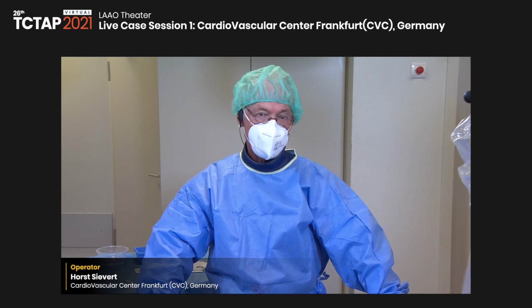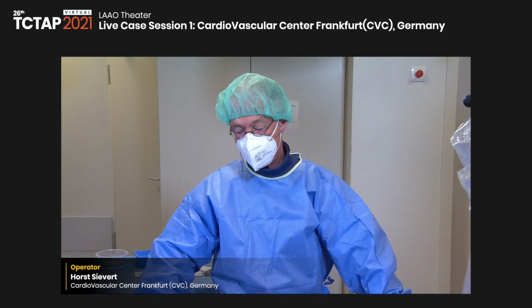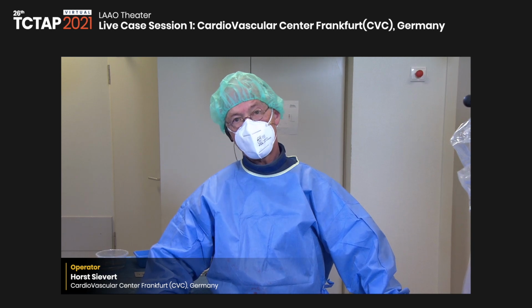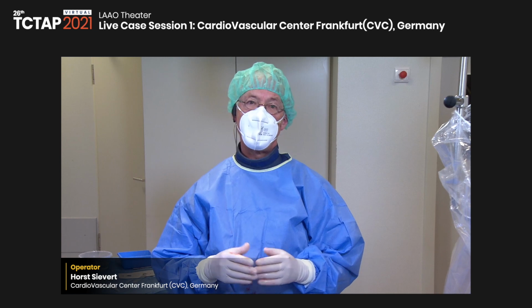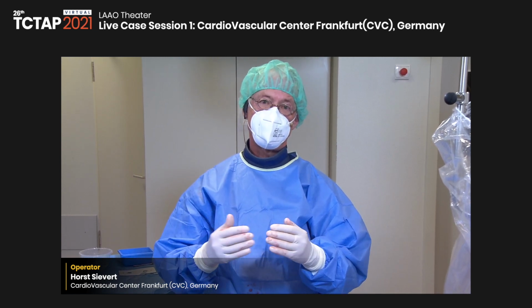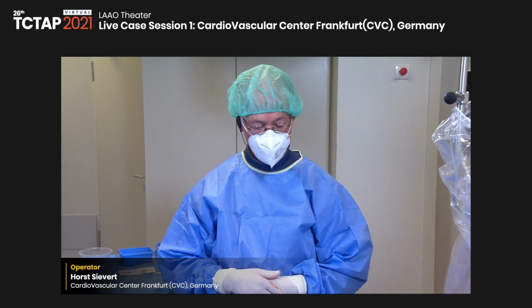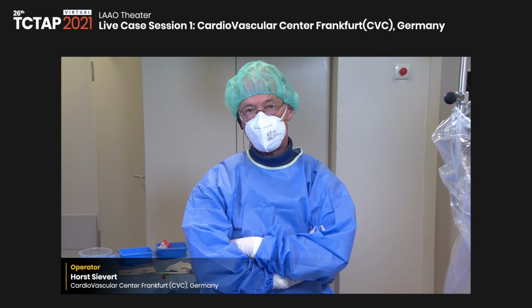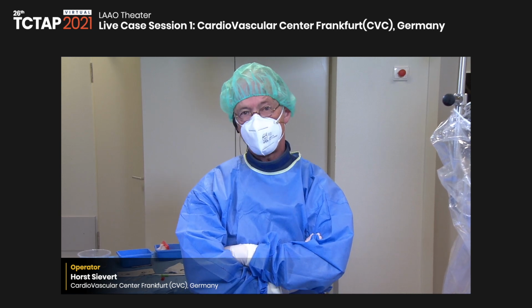Then there's the Lambre device, as you know, and it's available in some of your countries. That has some advantages compared to the other devices, and that is there is a special design available where you can place the distal part of the device in one of the lobes and still have a big cover to cover the entire orifice. So this is the special design that Lambre has. Sometimes there are cases which can be closed only with a Lambre device.